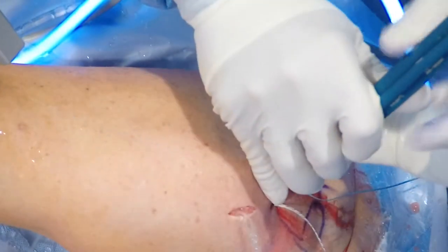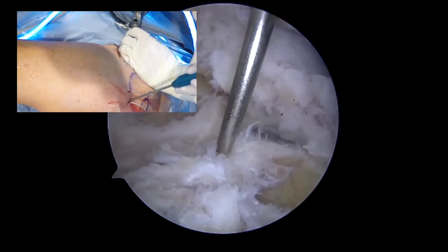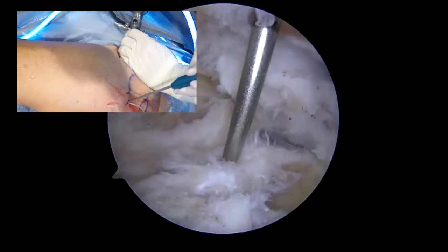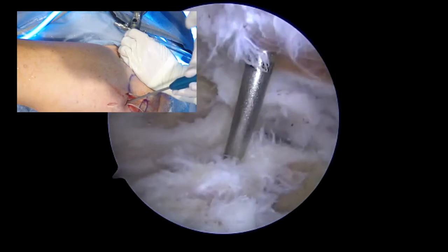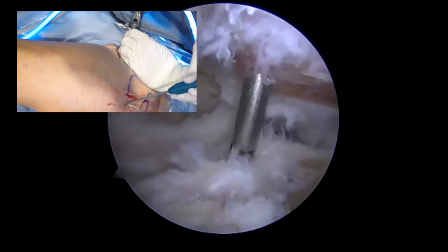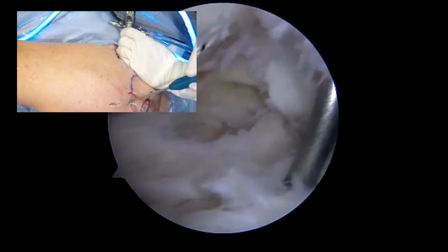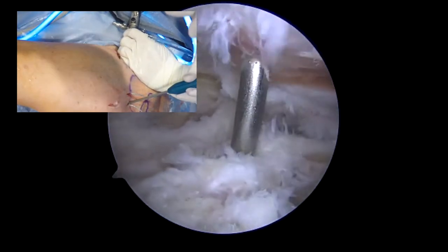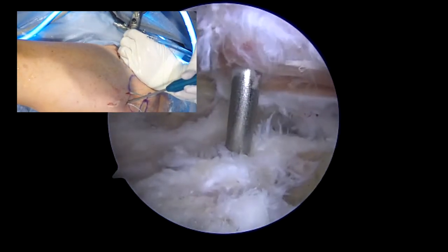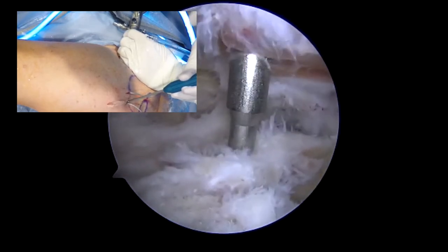Now we will be inserting the swivel lock anchors, which will go into the juncture of the articular surface and the greater tuberosity. This is essentially the medial row of the two rows that will be going on the greater tuberosity. In this particular patient it was challenging because of the previous anchors, and we had to ensure that we had good real estate here in order to gain purchase of the anchor.